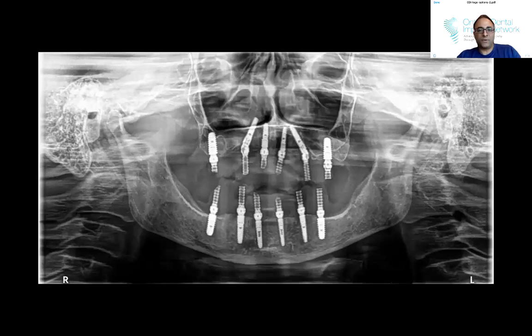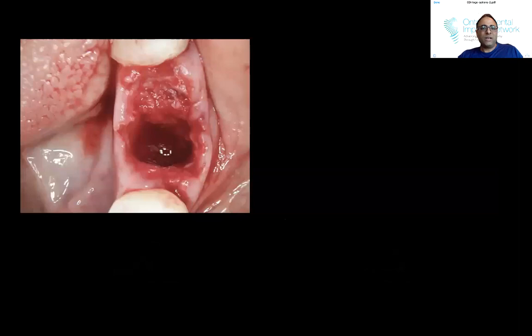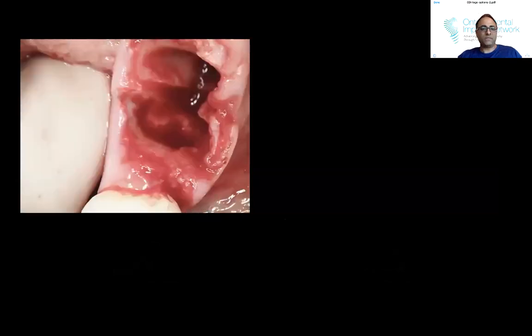And this is again another case where, I told you I'm not a big fan of all-on-four, so I will do bilateral sinus lifting, and you'll notice again we're engaging the cortical floor. So in a case where you have zero stability and the site is completely blown out, it depends again on your comfort, but in this case the patient was sedated. She made it very clear to me, do whatever you need to do to get the implant in. I'm okay if it fails. So your consents and your patient management and expectations are very important.